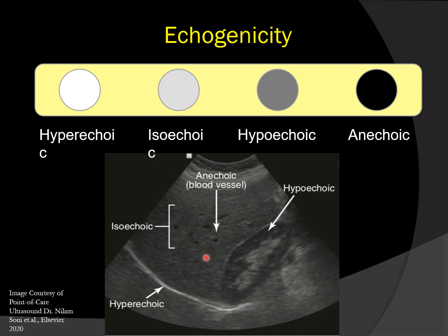So typically the liver is used as a nice anatomic structure to compare other organs to. And in a healthy liver, it is isoechoic. And we can use that to compare; what's pictured here is the kidney. So this becomes extremely helpful. Obviously, if the patient has underlying liver disease, such as cirrhosis or fatty liver disease, that may change the isoechoic architecture.